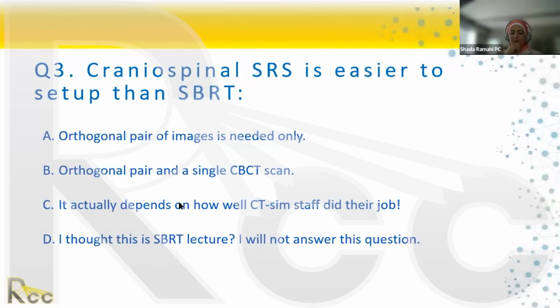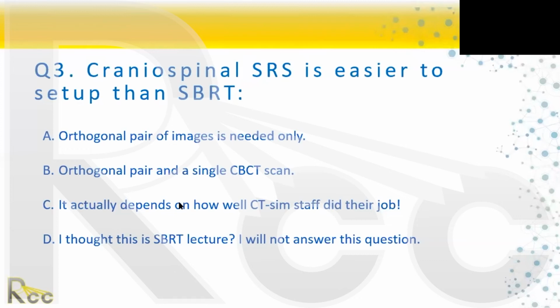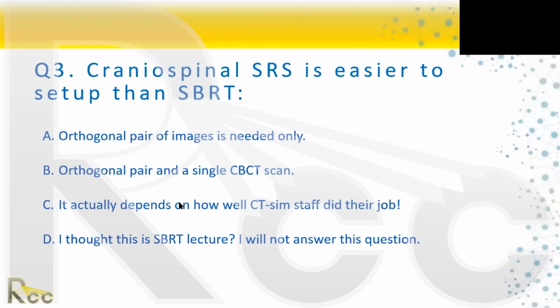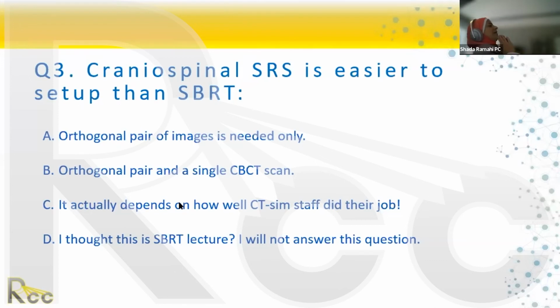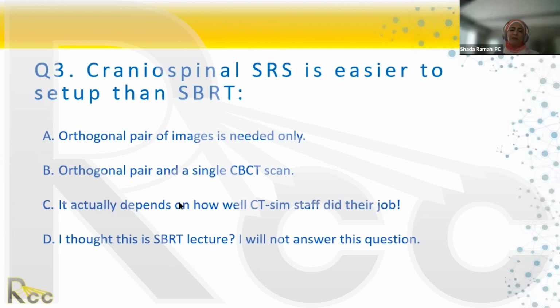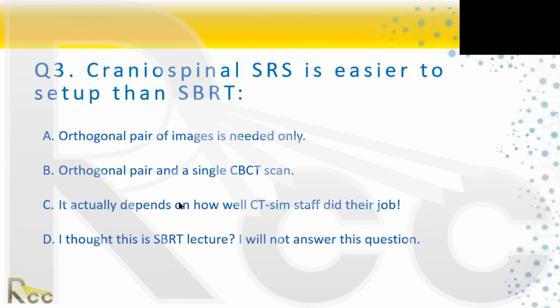Translational errors would be in mm, and you can do 2 mm, 3 mm or 4 mm. That means in and out, up and down, and left and right, as we said. If the neck has a pitch only, the couch cannot correct only one part with a pitch while the rest of the body is normal, because the whole couch will move. But the chest below, at the lung, at the xiphoid, has no roll. You cannot move one part of the couch. Rotational error is when we request the therapist to go inside and correct.